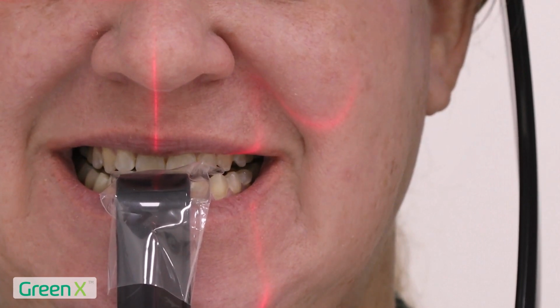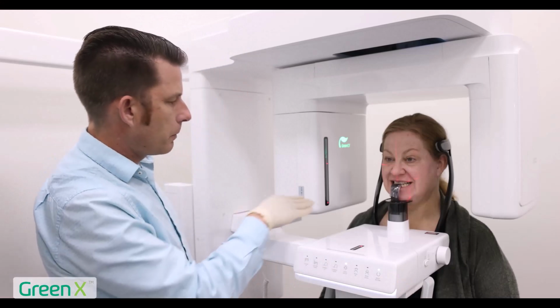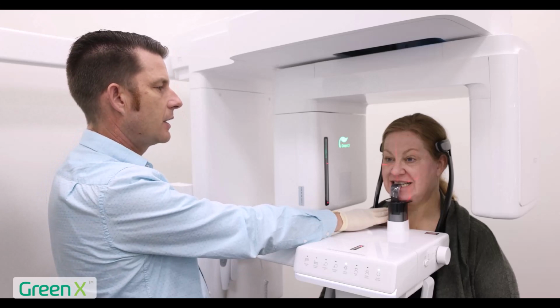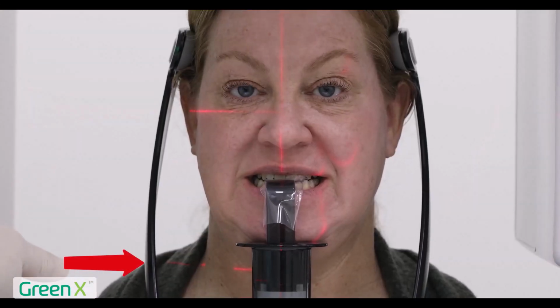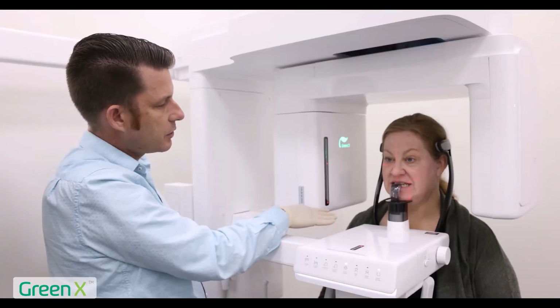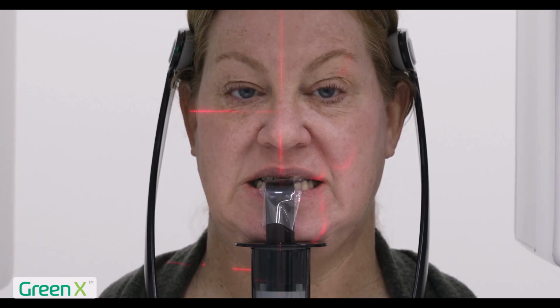Perfect. All right. One other thing to note, on the Green X platform, off of the X-ray tube head, there is also another beam that shines. This denotes the rotation of the device. If this beam is hitting the patient's shoulders, we may have to work with the patient on positioning, but as you can see here, it's at the base of the neck, and that lets us estimate the rotation of the device, ensuring the device will not hit the patient's head.